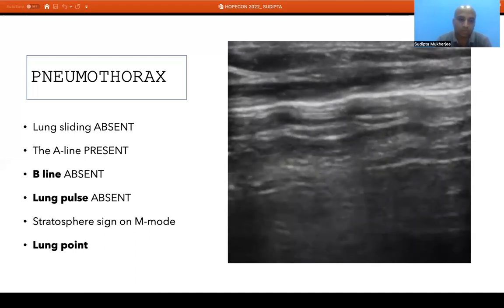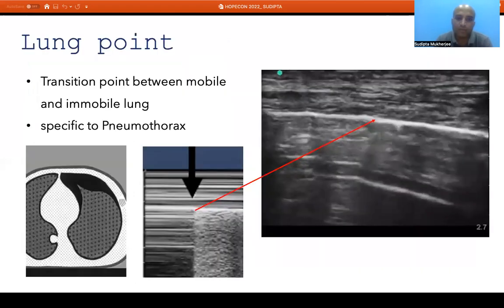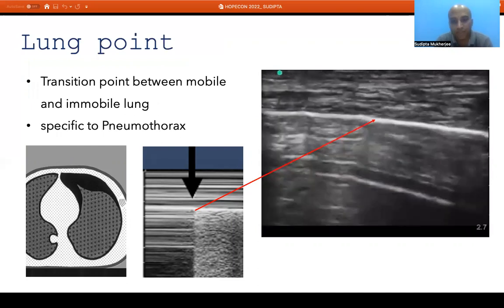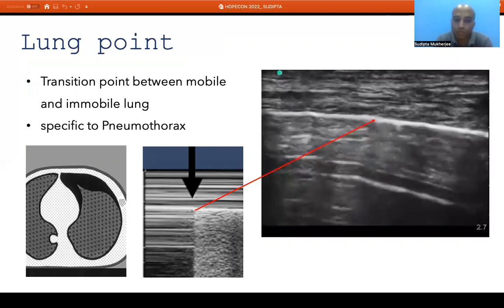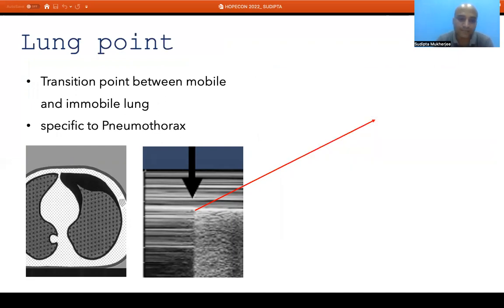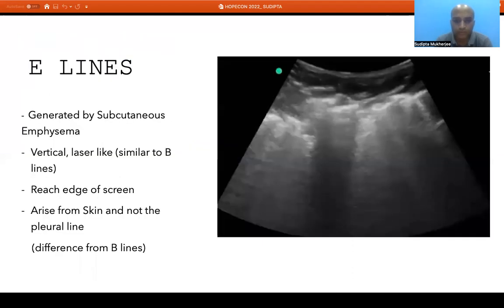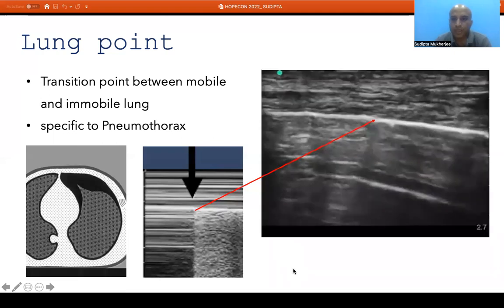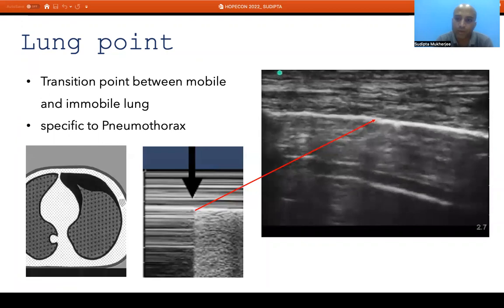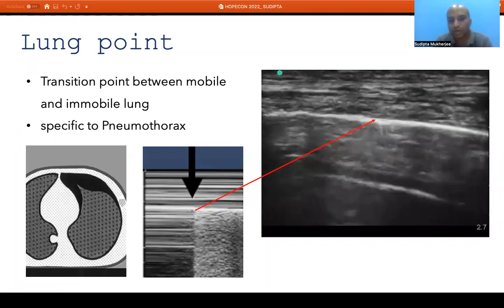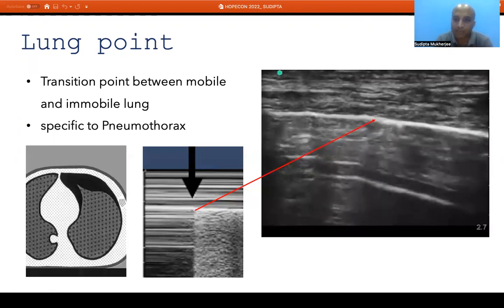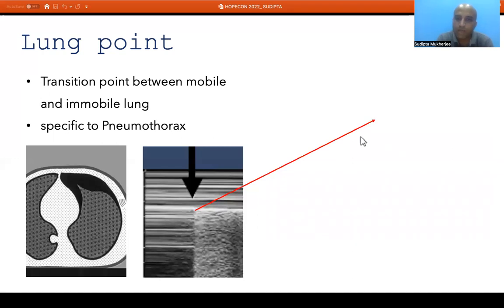Another key finding is the stratosphere sign on M-mode. Since the underlying lung is not getting ventilated and there is no movement, the lung zone appears as tissue — producing a barcode-like pattern — called the stratosphere sign or barcode sign. We can also identify the lung point: the specific point where parietal and visceral pleura get separated, visible as the transition from lung sliding on one side to absent sliding on the other. The lung point is pathognomonic — or near pathognomonic — of underlying pneumothorax.